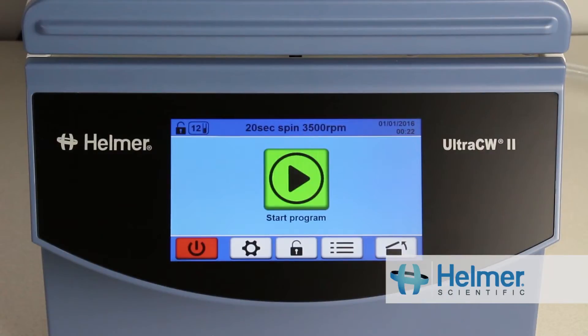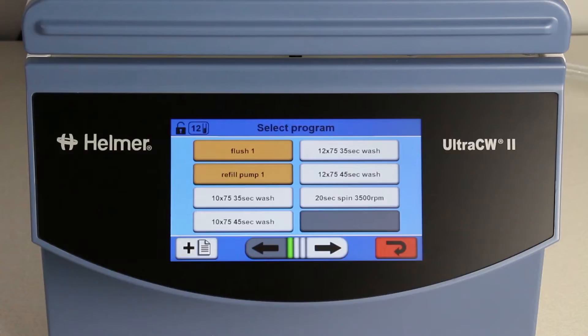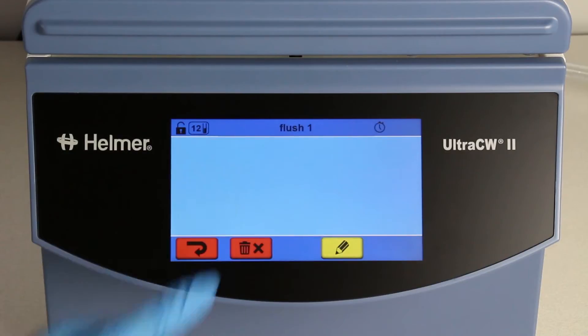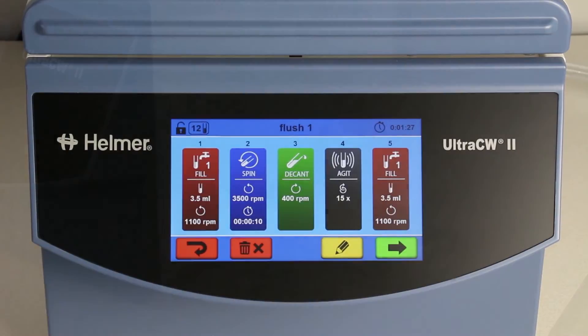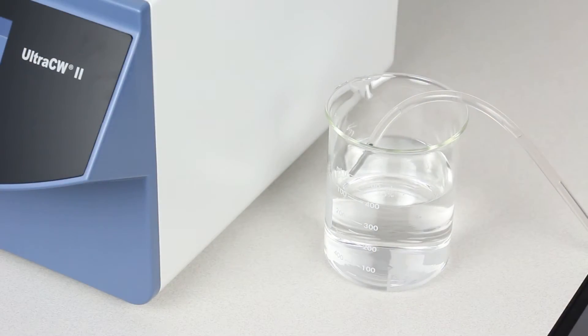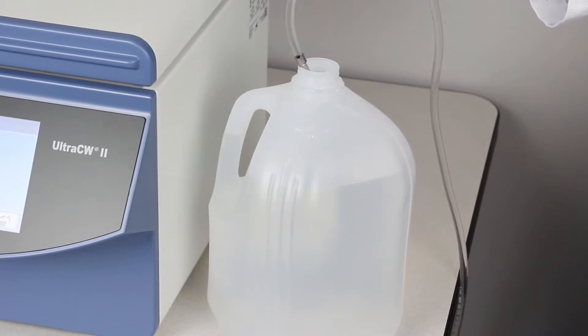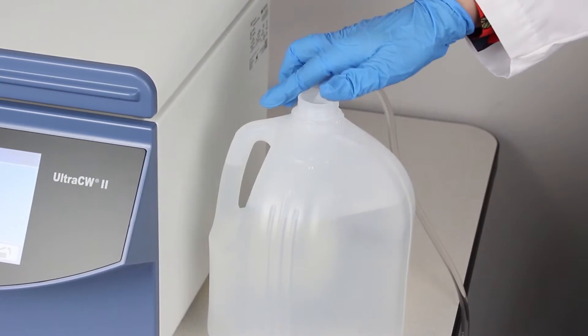This video provides a demonstration of the cleaning process for the ULTRA-CW2 Automatic Cell Washing System from Helmer Scientific. The ULTRA-CW2 offers a convenient cleaning procedure. The FLUSH program is designed to automatically clean the chamber and saline inlet and outlet, eliminating the need for manual cleaning and reducing downtime.